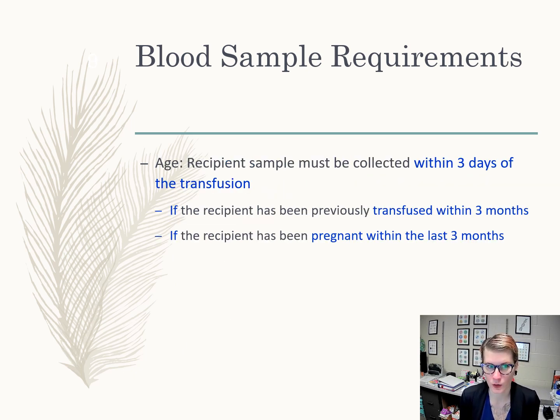Compatibility samples are only good for 3 days after collection, and typically you want to try to cross-match only up to 3 days before the transfusion, because if the patient's in the hospital, there might be something going on where they could be developing antibodies or something could change. So you want a recent sample so that you have a recent picture of what's going on in the patient.